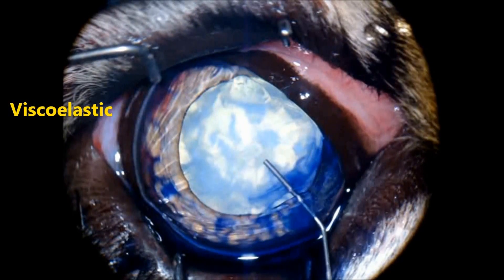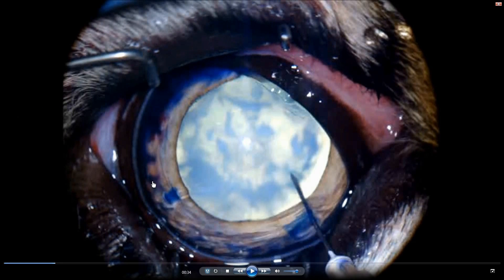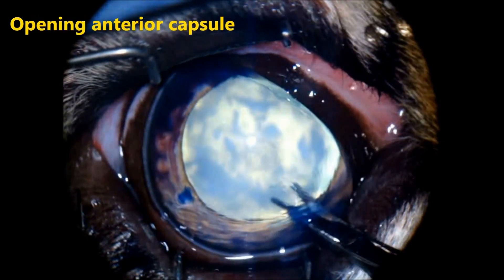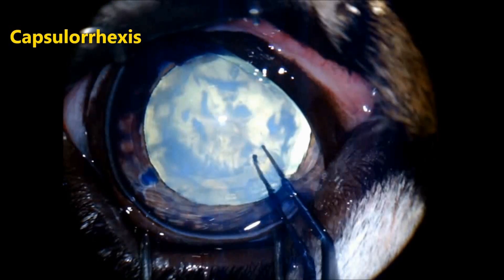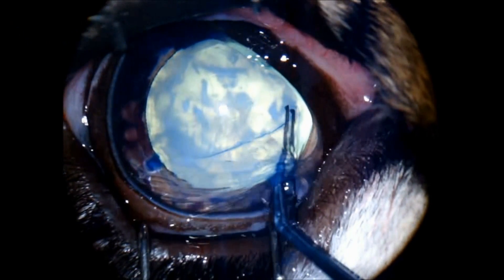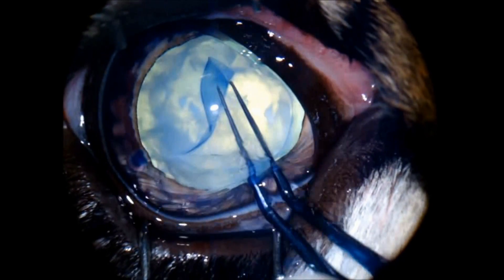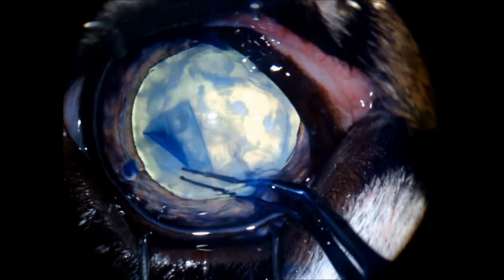Viscoelastic into the anterior chamber. You can appreciate a little bit of hemorrhage all over the peripheral part of the iris — this is quite common in this species. Opening the anterior capsule to perform the capsulotomy: first you puncture with a needle and then enlarge with scissors, then using the Utrata forceps, performing the capsulotomy. Look how thin, elastic, and delicate the anterior capsule is — one should be very careful not to make radial tears.